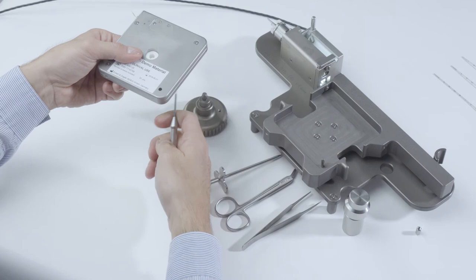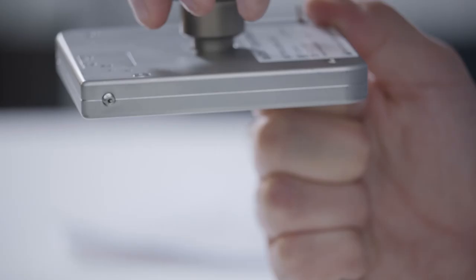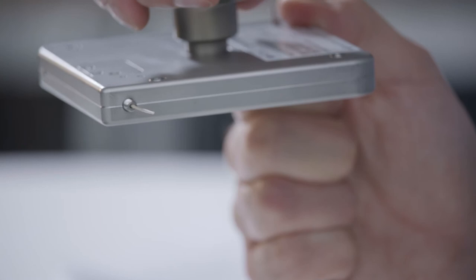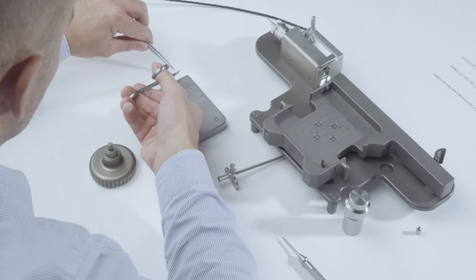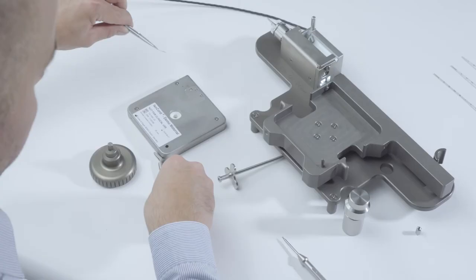The damaged end of the seed chain must be removed. Move the seed chain out of the magazine manually until the first undamaged spacer is fully protruding from the socket on the magazine holder. Next, grasp the damaged end with the tweezers and use the scissors to cut through the center of the undamaged spacer.